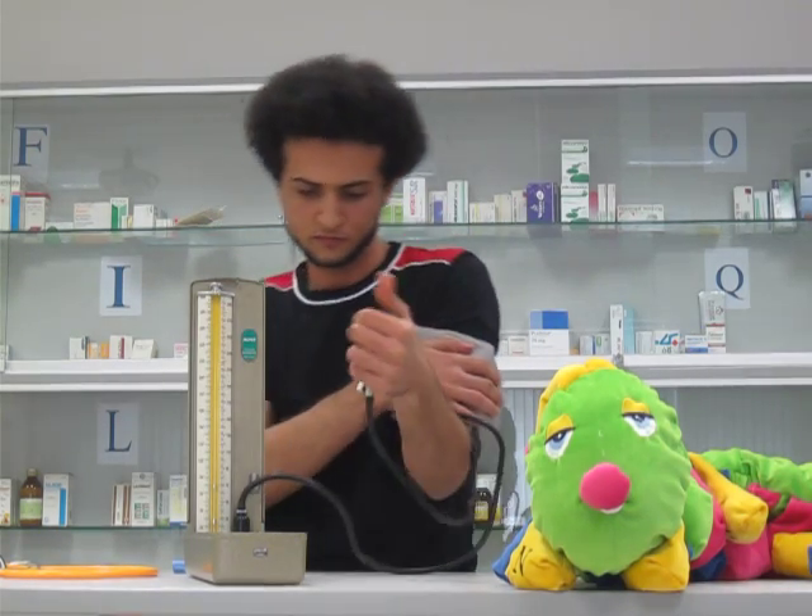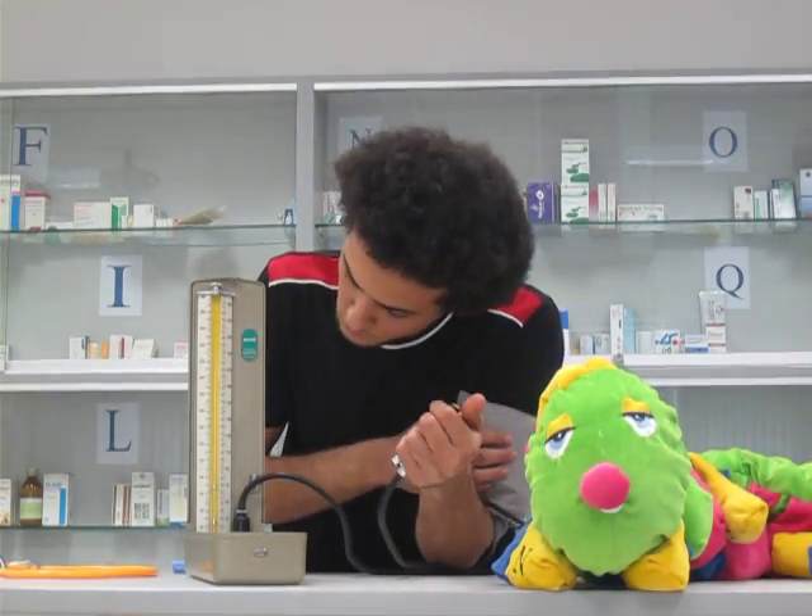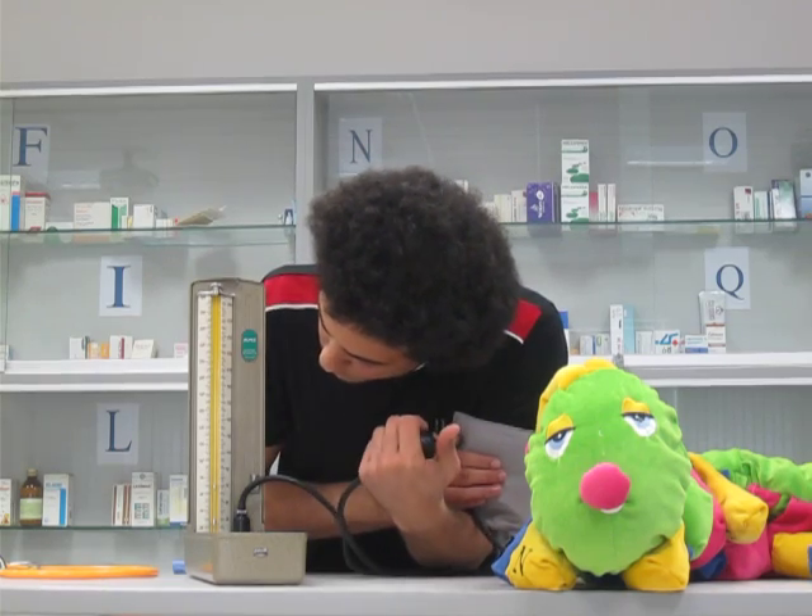Then you keep pumping until you can see the pressure in your arm. It is all pumped up. And then you see the mercury column.